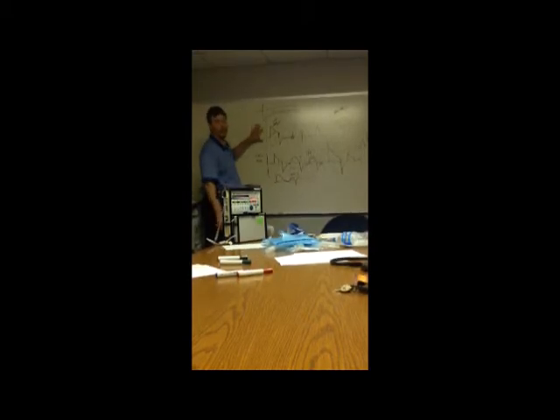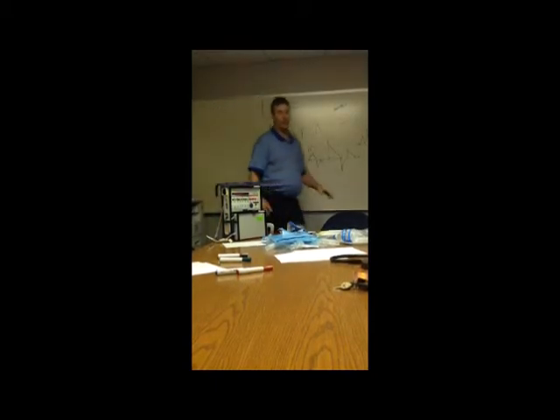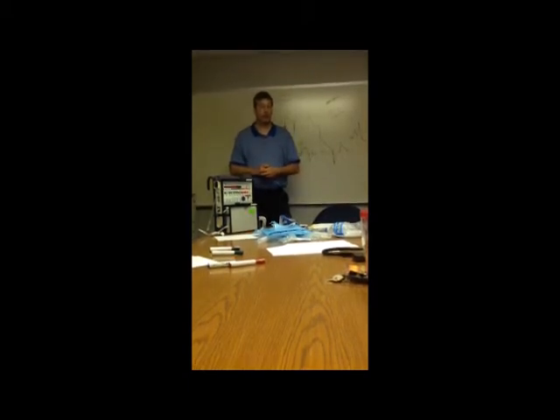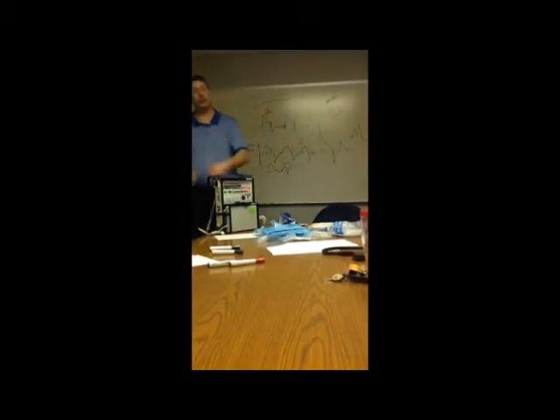So, if this guy's air hungry, you go to this, okay? If you get them on CPAP, PSV, go to this anyway. Just switch them over anyway, all right?